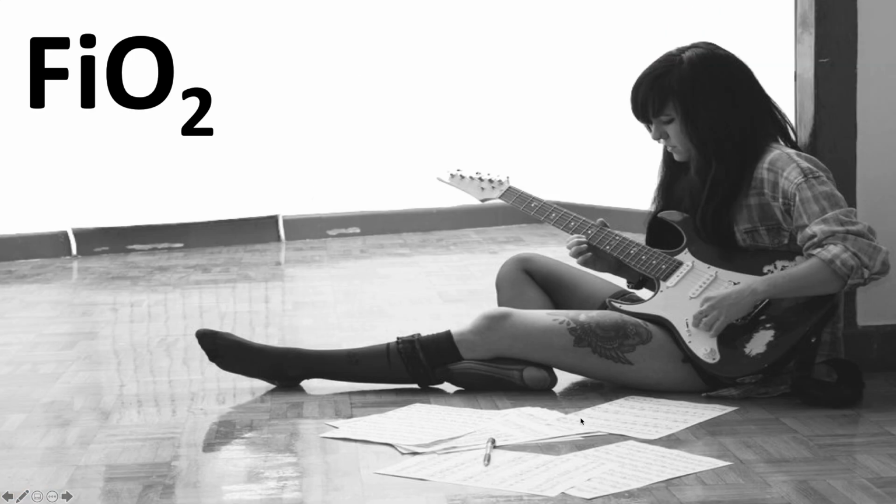Then FiO2, so inspired oxygen. Oxygen is one of the main reasons we ventilate someone. We really want to augment their oxygenation. So this is the lyrics of the song. This is really the meat and potatoes of why you write a song. And so it makes sense that oxygen is important and we want to include it.